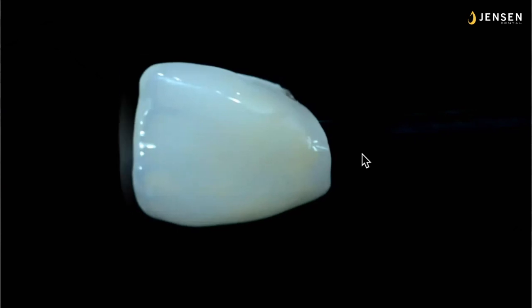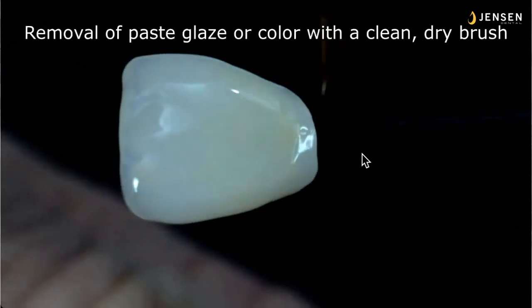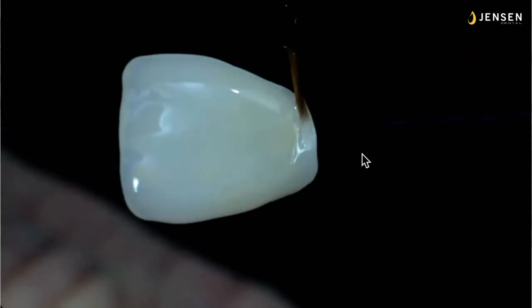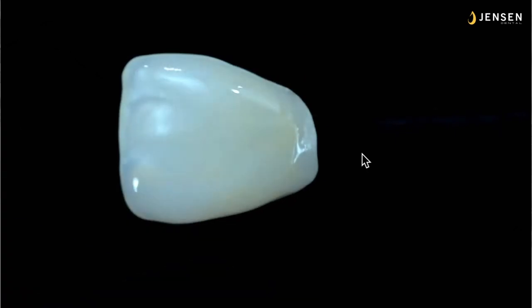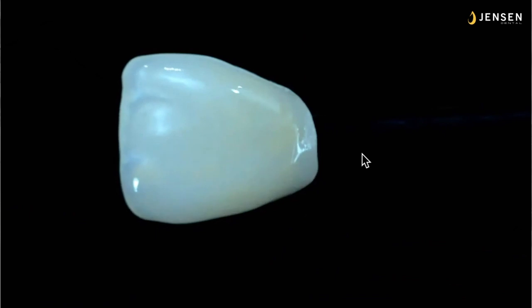Never get crazy. Always be gentle with this. And if you do anything wrong, you can always wipe it off. Now if you're trying to erase anything, I've always said to clean the brush and get a little glaze liquid in, but if you use a dry brush, it'll grab the color or grab the paste glaze, and you can see me wiping it right off the zirconia.